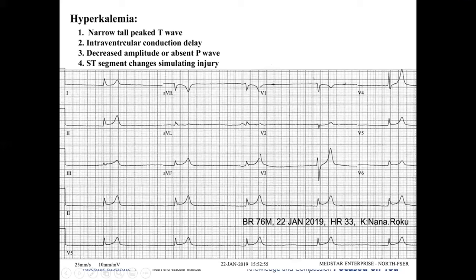The V2 QRS complex, that is a deflection before the QRS complex. Previous complex, sir, just before the QRS complex. Oh, this one. Yeah, this is actually possible, but it's tough to say. I never comment on a single complex because I have to have a few more complexes.